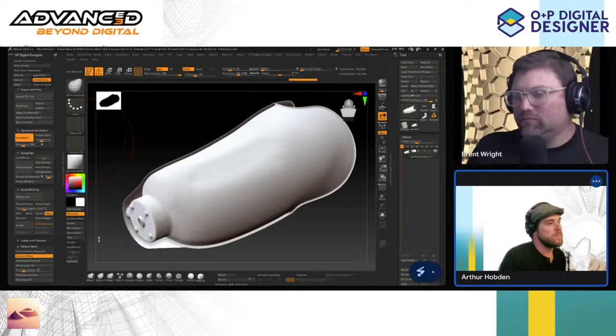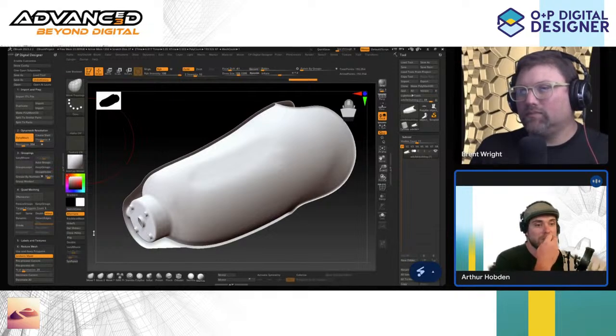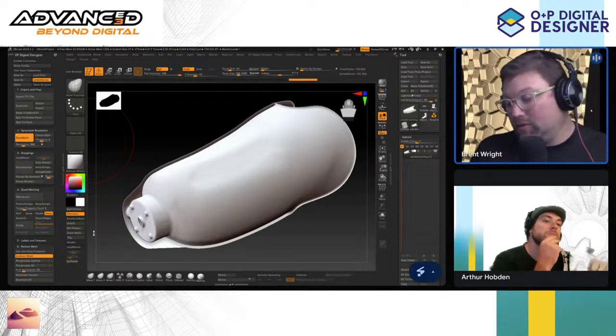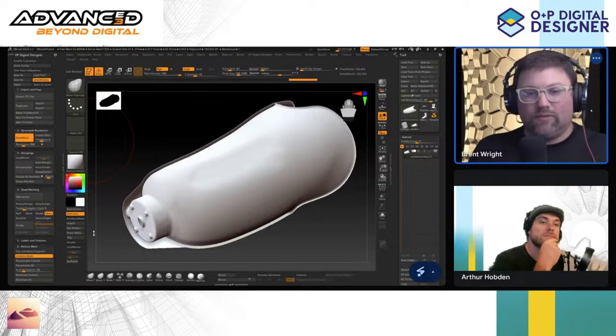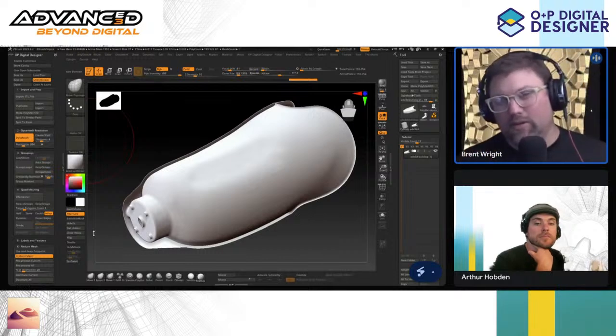So people can sign up on your website, right? And you guys would approve them, and then they can try out for themselves, creating designs, ideally to be printed through you, I imagine. No, so we want them to be FDM printing their own stuff. We could print their test sockets, but we truly believe in putting the power in the clinician's hands. And then when it's time to go to a definitive socket, hopefully you think of us, and we'll 3D print your definitive socket after it's been fit. But this is really a tool for the masses to be able to get a transtibial socket very quickly.